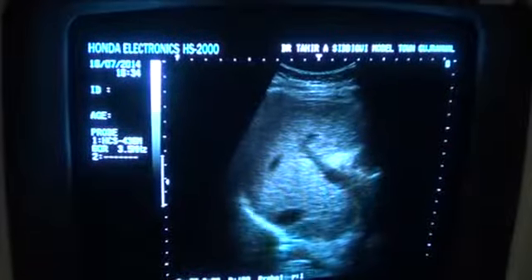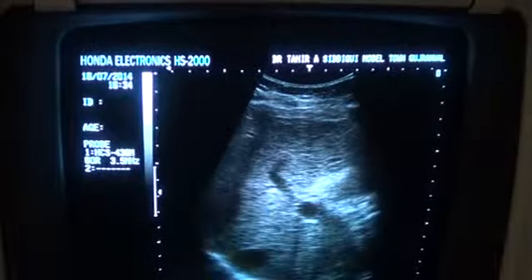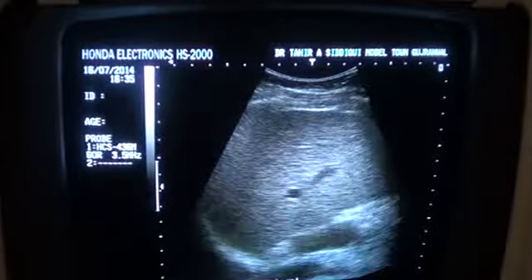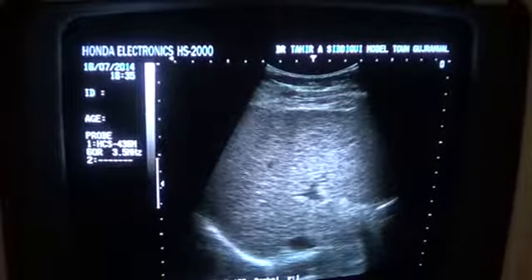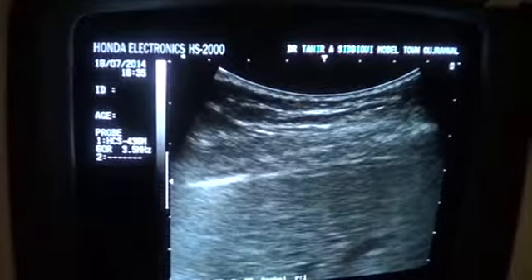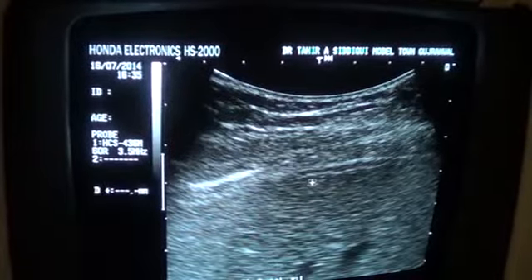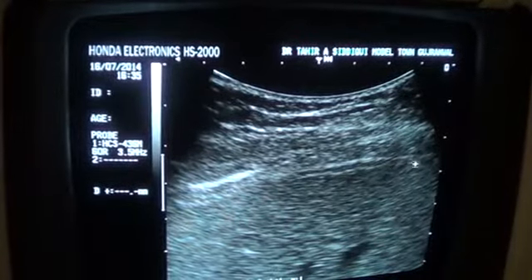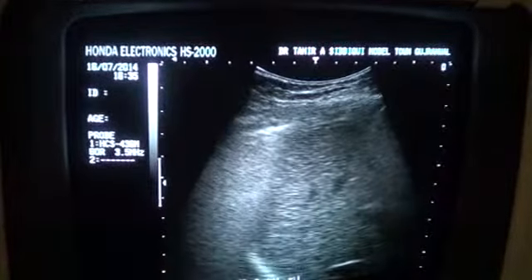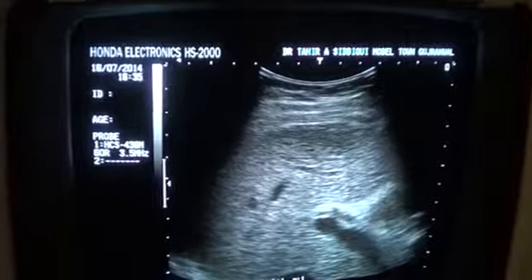Well, this is an ultrasound study of a known case of hepatitis C, diabetic, and the liver is showing you chronic liver parenchymal changes with outer surface seen mild irregularity of the outer surface can be seen. In this case, this is the outer surface of the liver and it is a bit irregular, and you can see the coarseness and increased parenchymal echogenicity of the liver parenchyma.